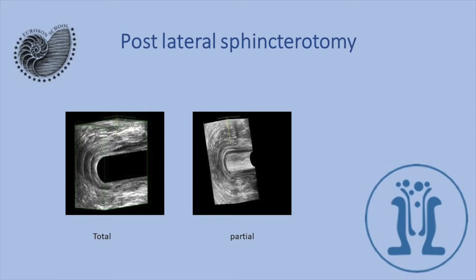Here we see anal sphincters after lateral sphincterotomy. Lateral sphincterotomy is an operation for anal fissures, and here we see a correct lateral sphincterotomy because it is only partial — here is the internal anal sphincter in the left position. But here the internal anal sphincter is absent, and the patient still has complaints because his fecal incontinence was not due to anal fissure.